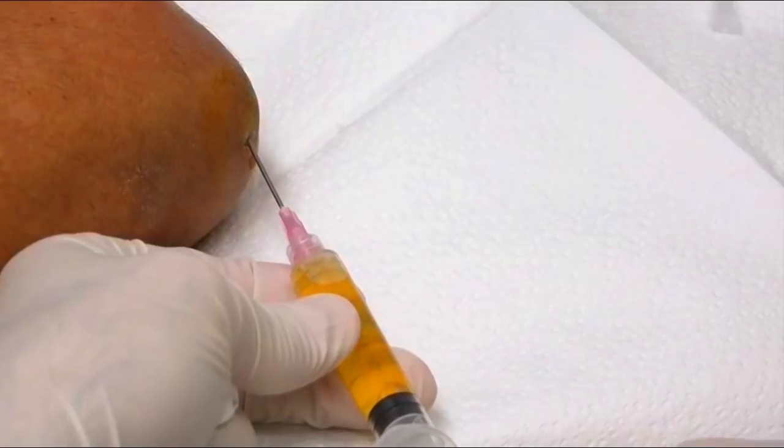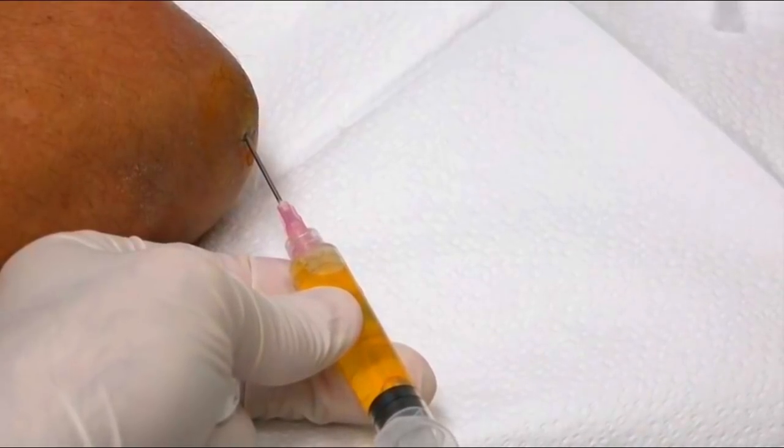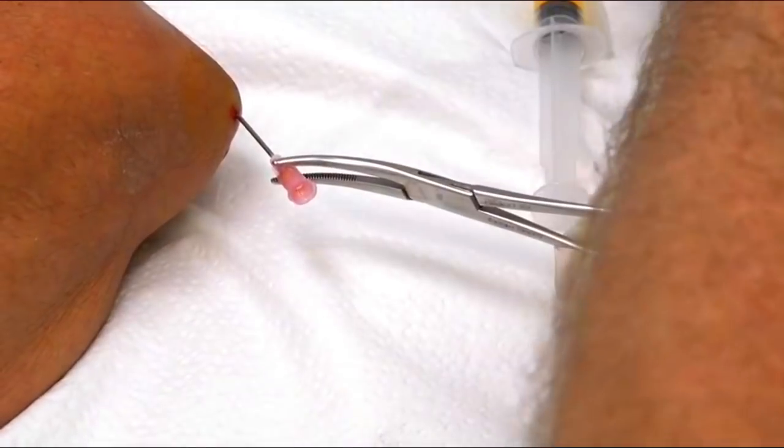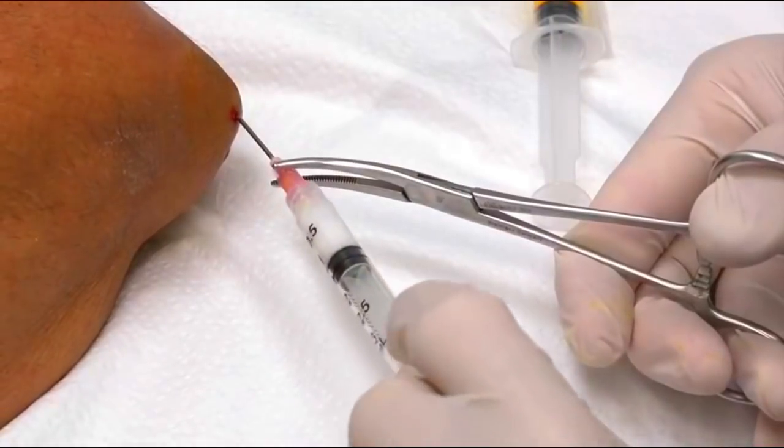Here comes the fluid — nice straw-colored, what we would call bursitis fluid. We're gonna take this first syringe off and swap it out. You know what, this thing is empty, so we're gonna go ahead and put a little cortisone in here.